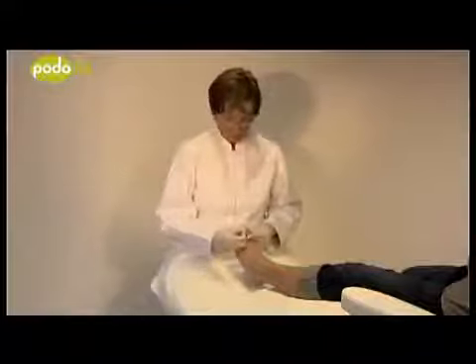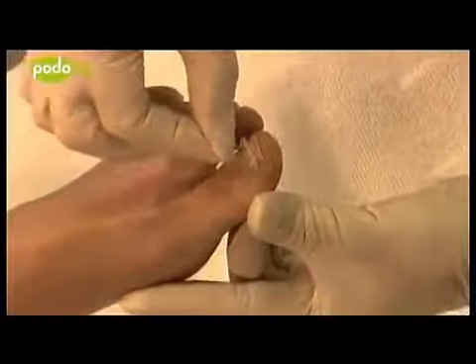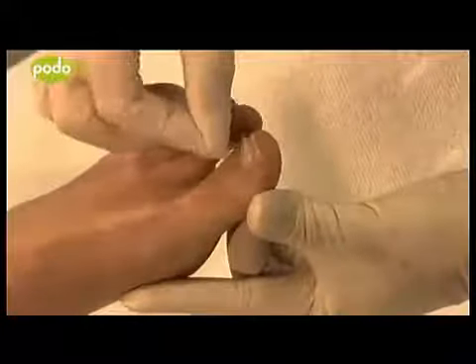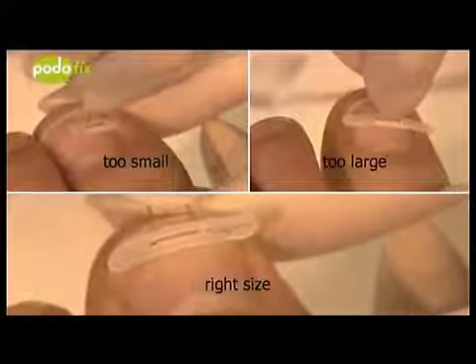The size should be chosen so that the brace can be adhered at least to the ingrown side of the nail, as close as possible to the edge, but so that it does not press on the nail crease. A smaller size brace can in general be used, which is then placed as close as possible to the affected nail side.